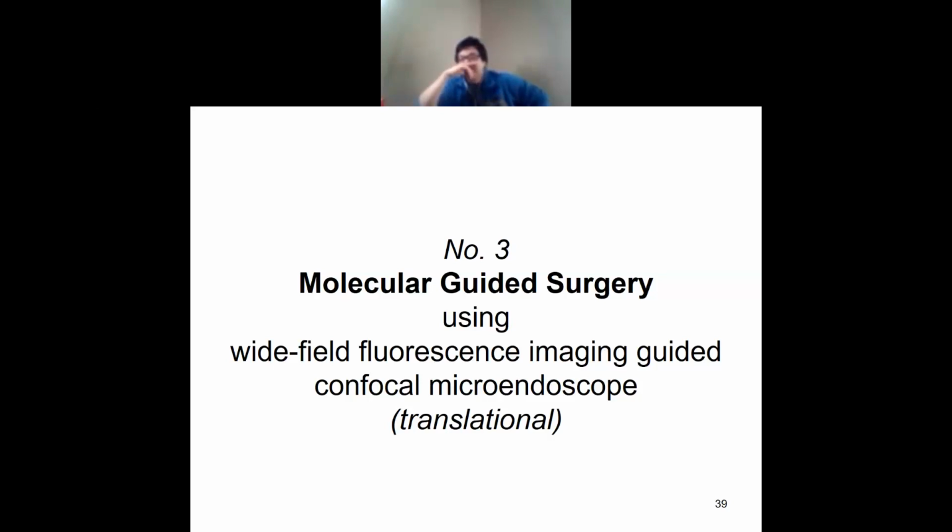That's also why image processing is key. You have to use a compensation algorithm to stabilize the imaging. For example, in the mosaicing system, it's not simply stitching all the frames; it also has cancelation and stabilization through optical flow.